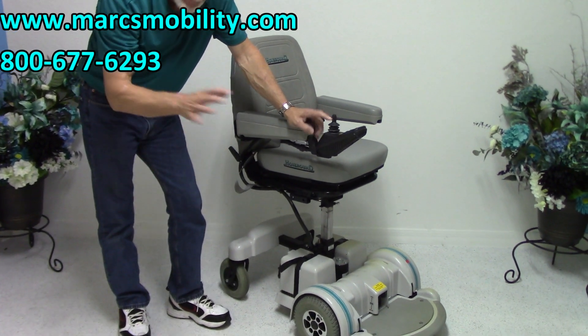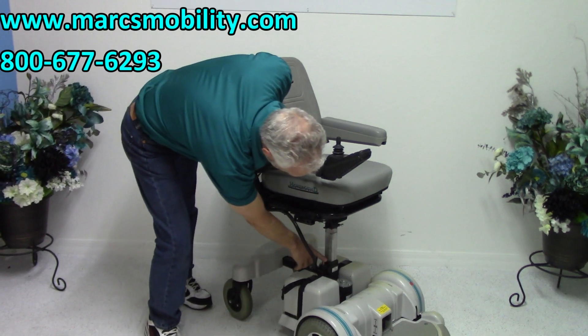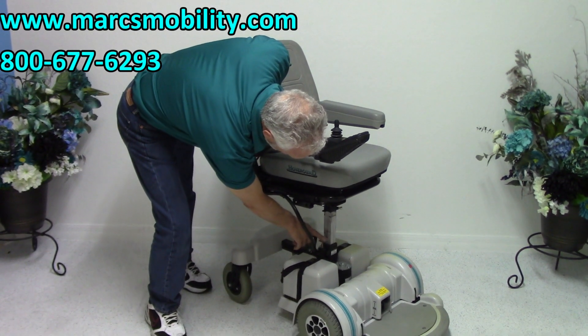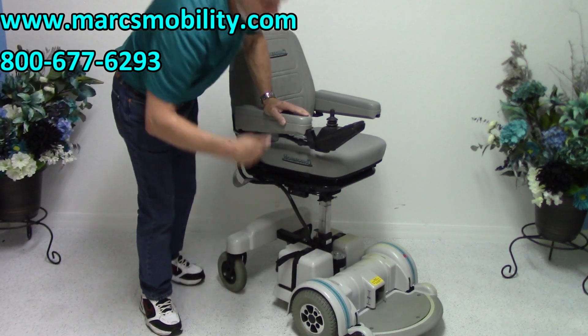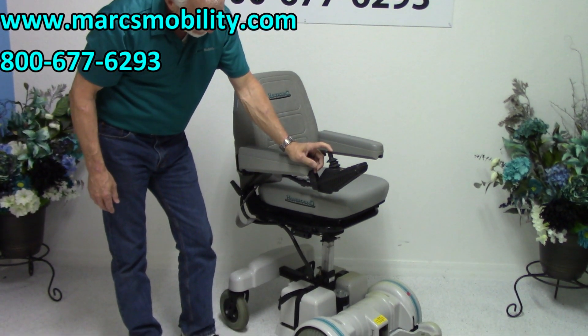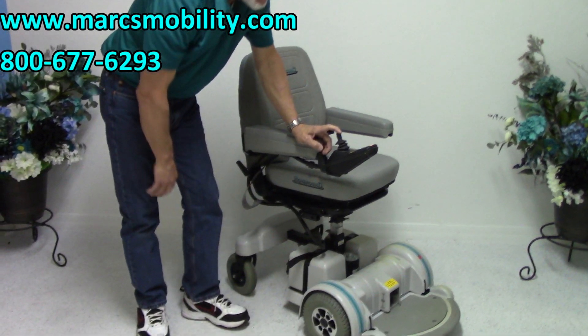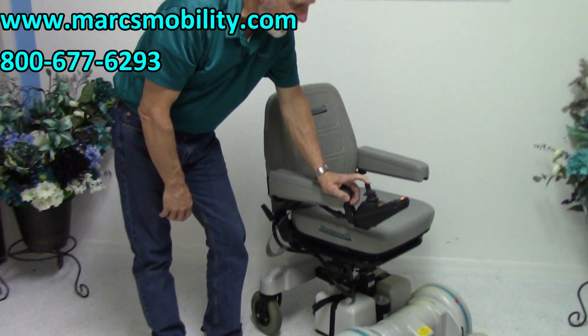This chair will not drive with the seat elevated — it will only drive once the seat is back down. It pushes this sensor right here; when the seat comes down and pushes that sensor, the chair will drive again. If I bring the seat back down, it'll hit that sensor and the chair will drive again at full speed.